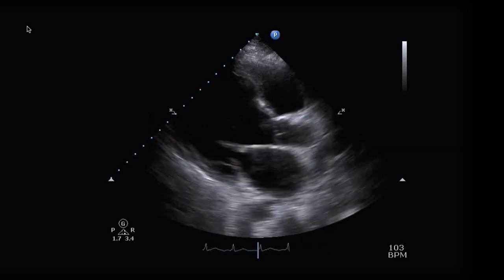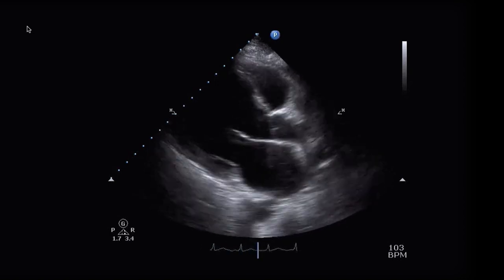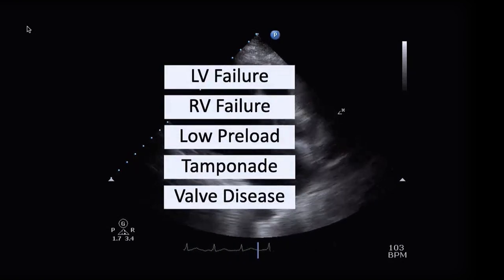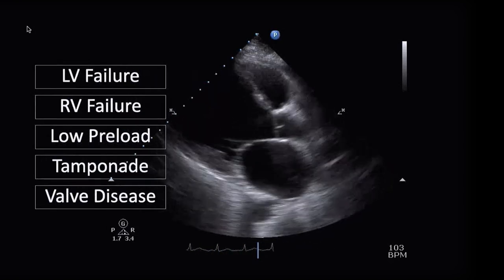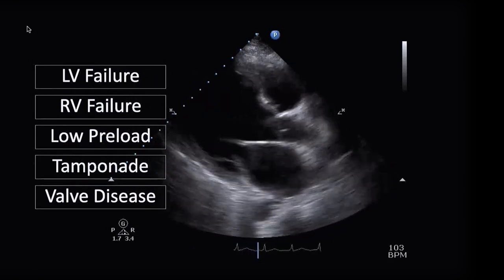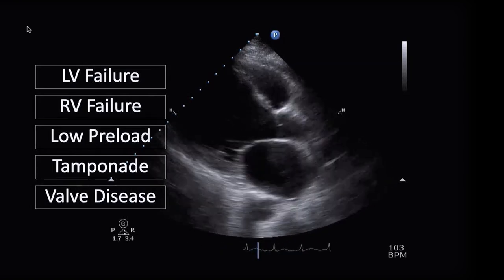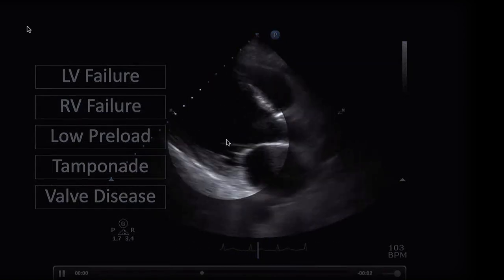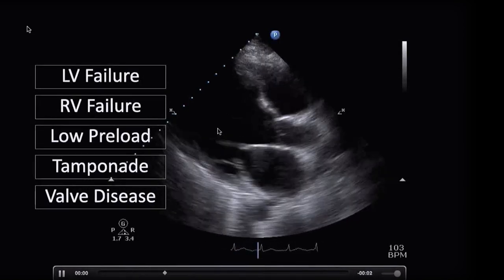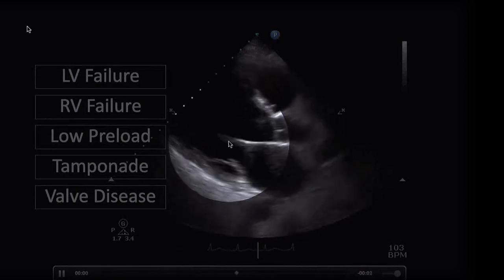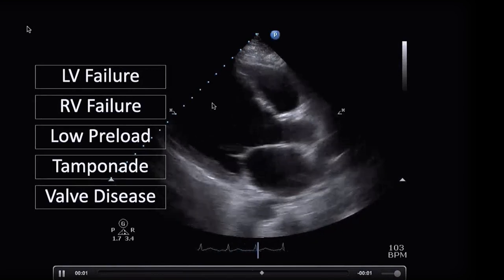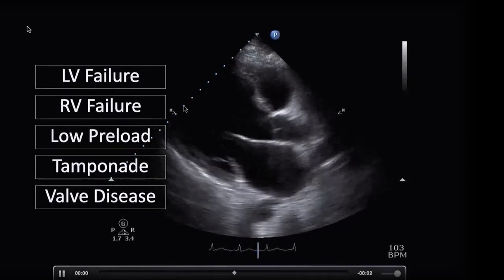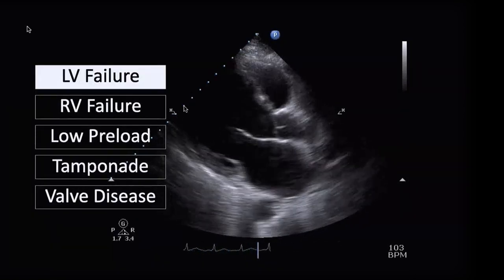These are the five characteristic abnormalities seen in a hemodynamically compromised patient that echo picks up: left ventricular failure, right ventricular failure, low preload, tamponade, and valve disease. Patients don't come with labels, so here's a case. The first thing my eyes see is a quite large ventricle — it looks really wide and isn't squeezing toward the middle much. There's not much change in shape or size of the chamber, and the mitral valve just isn't opening fully — it should be opening widely.